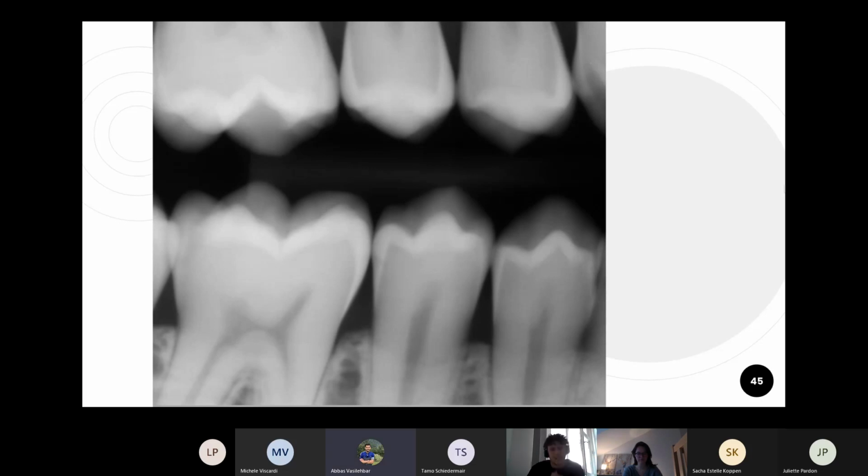Sorry. Okay. Yeah, just on 4.5, you can see a little conical shape of the caries lesion, interproximal between the teeth. So yeah, really keep your eye out for those. Sometimes they're really hard to see. Okay, next X-ray.